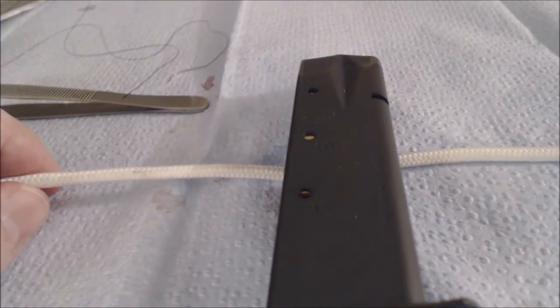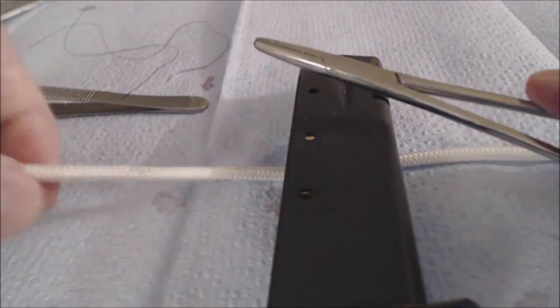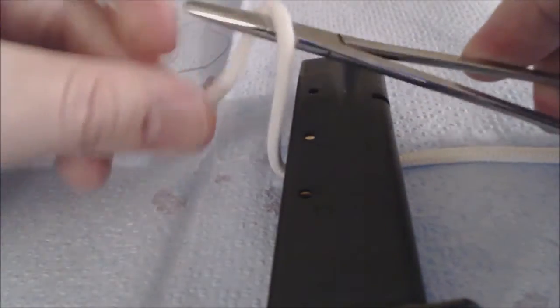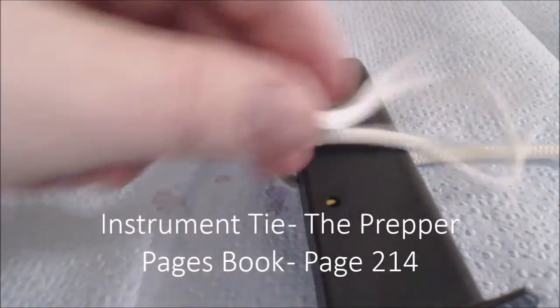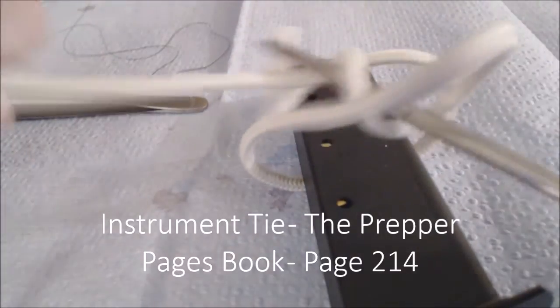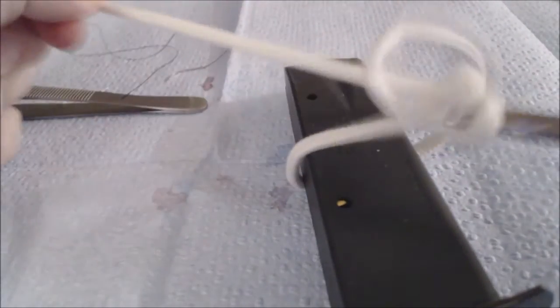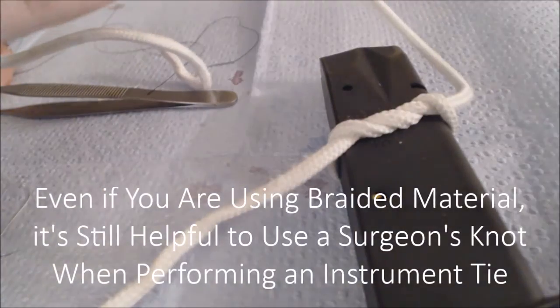We're back now to our practice setup in order to further demonstrate the mechanics of an instrument tie. Here we have our needle driver and we're going to wrap the suture material around twice. Then we're going to find the end of the suture material and pull it through. As we do, we'll see the knot lay down nicely.